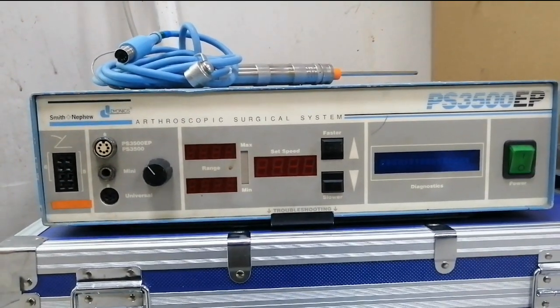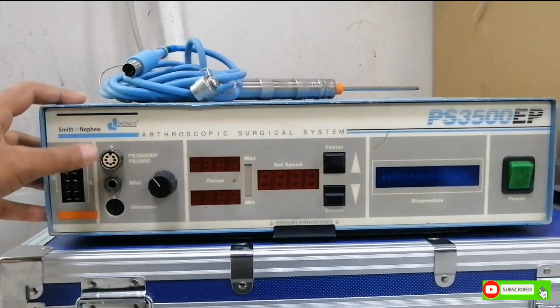So those are all the functions for operating this machine. If you have any questions you can ask me in the comment section. Thank you.